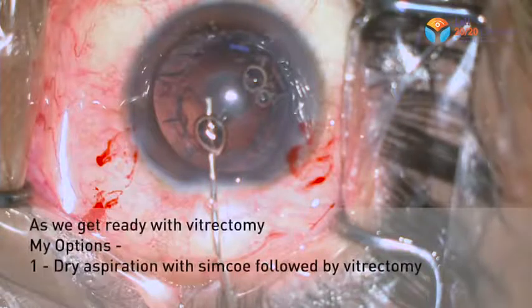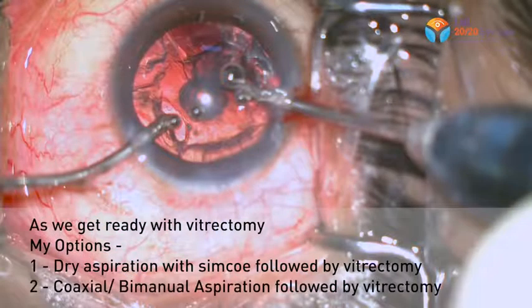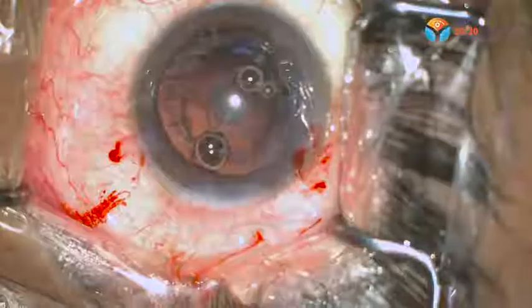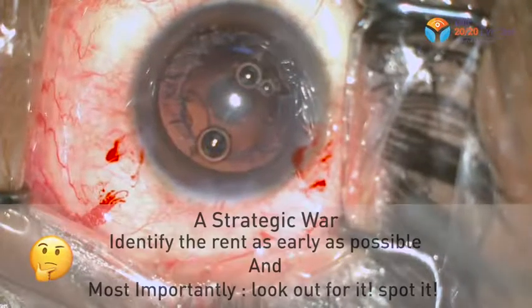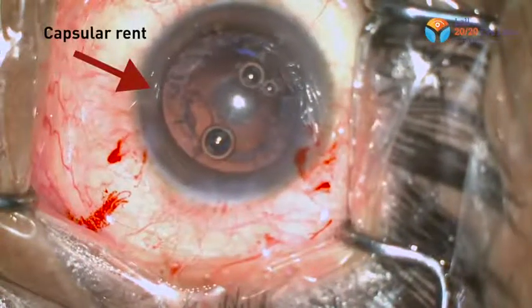Option 1, dry aspiration with Simcoe's cannula, followed by anterior vitrectomy to aspirate the residual cortical matter. Option 2, a usual bimanual aspiration or coaxial aspiration cannula to remove as much cortex as possible and then do a vitrectomy.